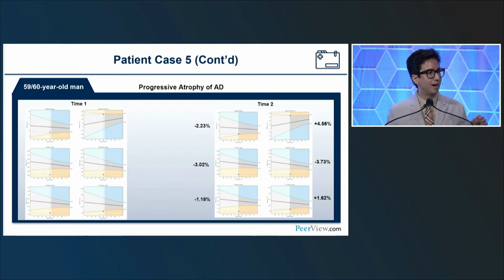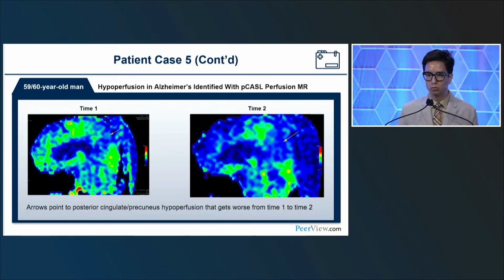Because progressive atrophy, not just low brain volume at any one time point, is a key finding in Alzheimer's disease and neurodegenerative disease in general. And so longitudinal imaging is going to be very important. So if you're reading a study and you're not sure if these low brain volumes at one time point mean anything, get a follow-up scan in a year and you'll have greater confidence in the progressive atrophy. And of course, perhaps having other fluid biomarkers of Alzheimer's disease pathology as well.